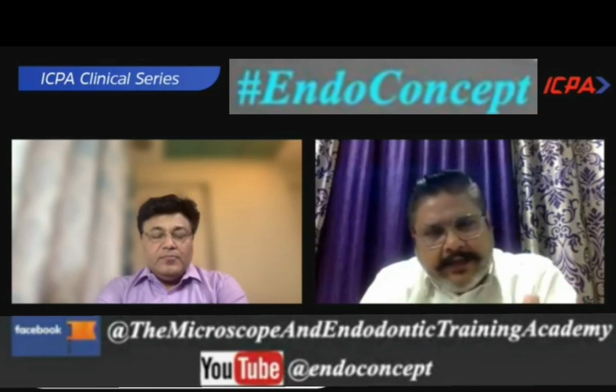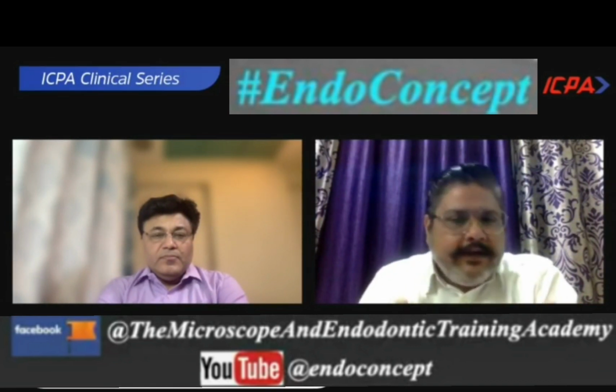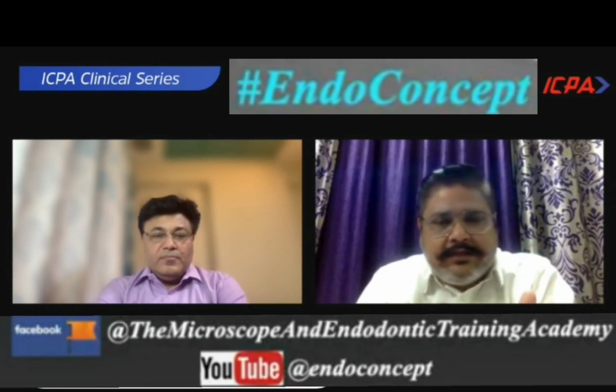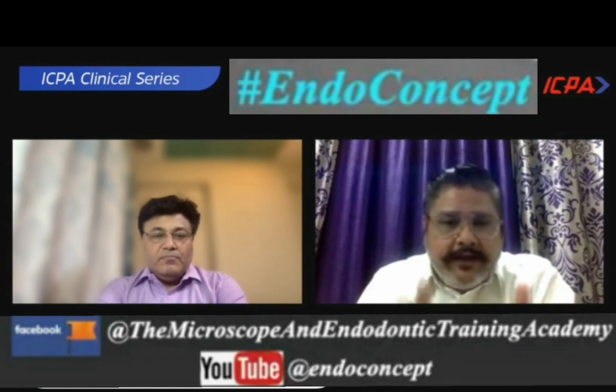And in my experience, I have seen that calcified cases mostly come in the vital state. So identifying the bleeding spot is very easy, and it really helps to open up the canal. Otherwise, just digging around and landing up in perforation of the floor or somewhere else, if you have microscope, it is very easy to locate a calcified canal.